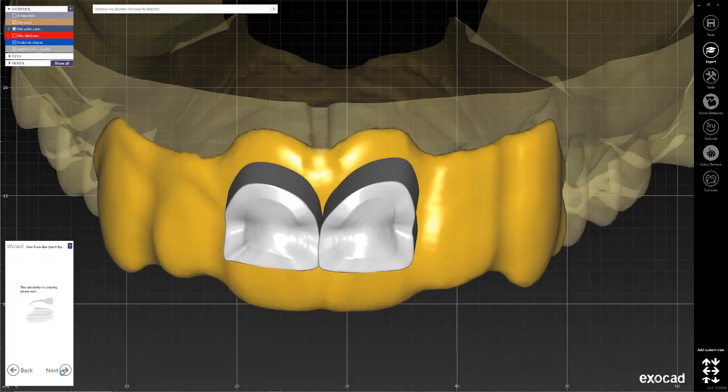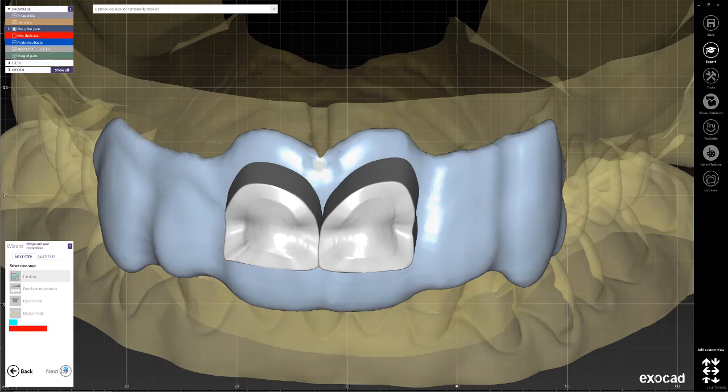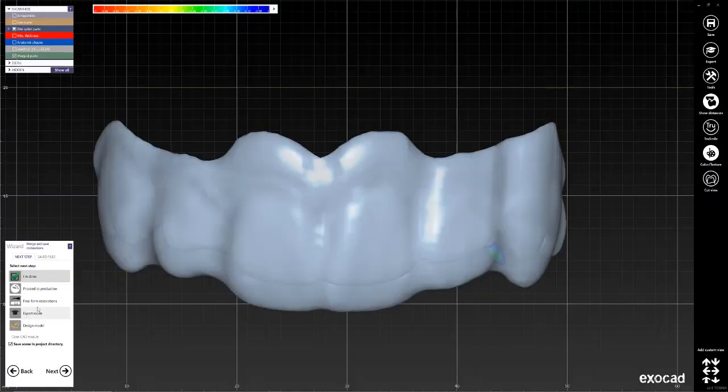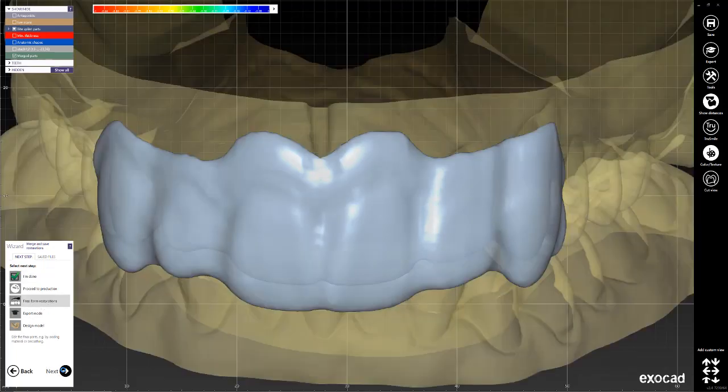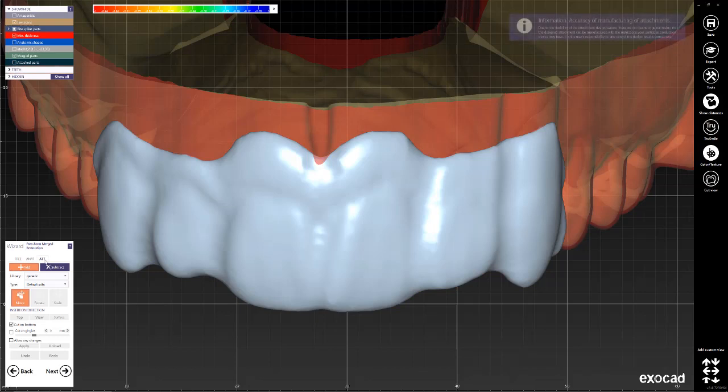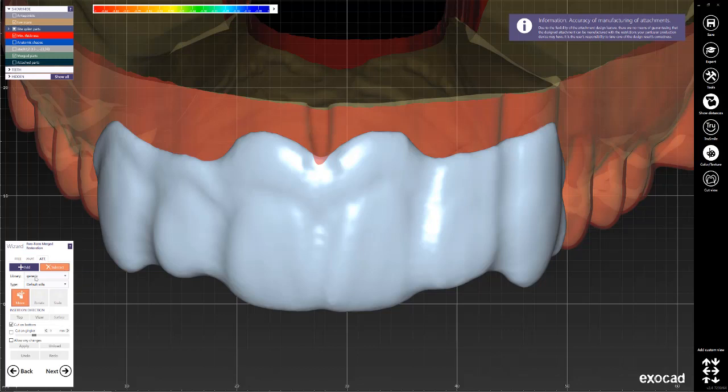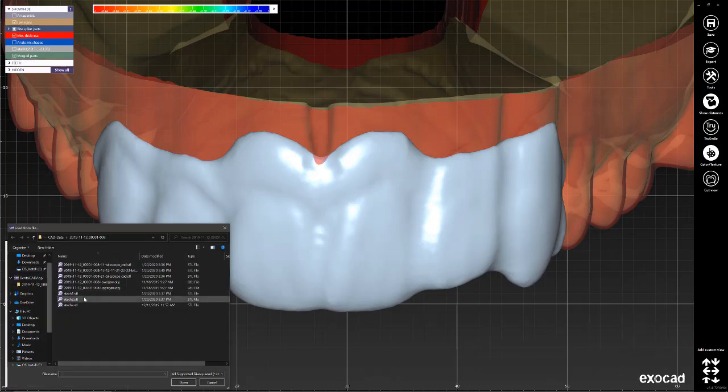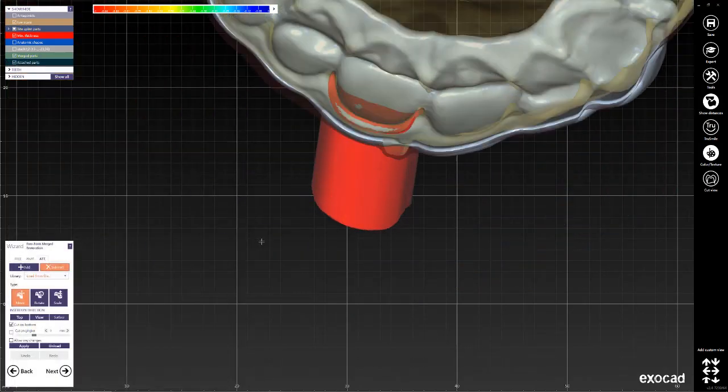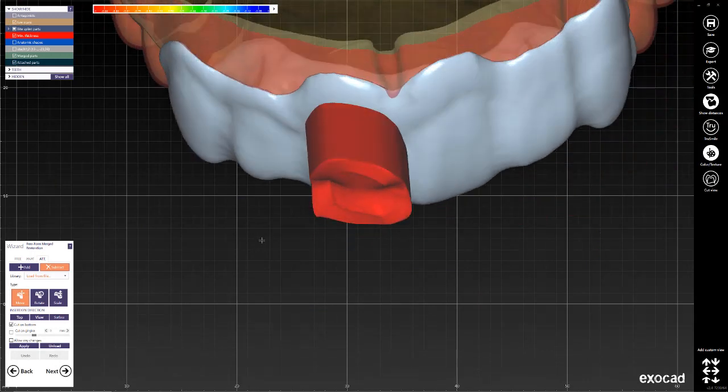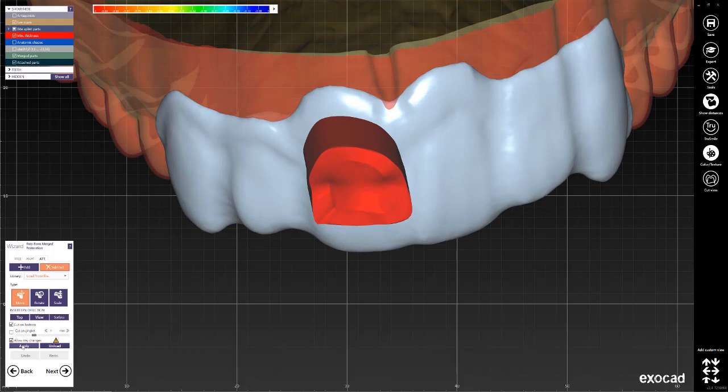Once you're done with the design process, we are going to go to freeform restorations. That is really important. Now we're going to go into attachments, we're going to go into subtract, and then in the library menu you're going to scroll all the way to the bottom where it says load from file. So we're going to bring that in and we're going to bring each attachment individually. That's perfectly placed where we want it to be. Make sure that you click here where it says allow any changes and click apply.